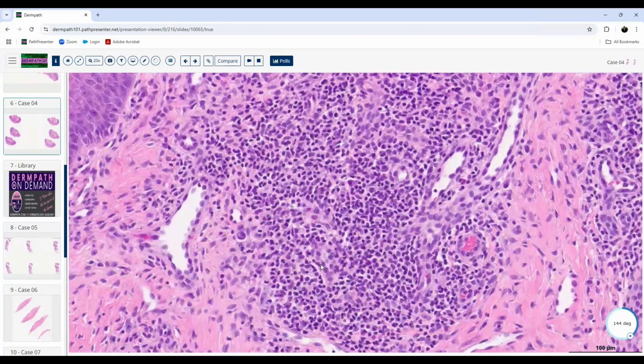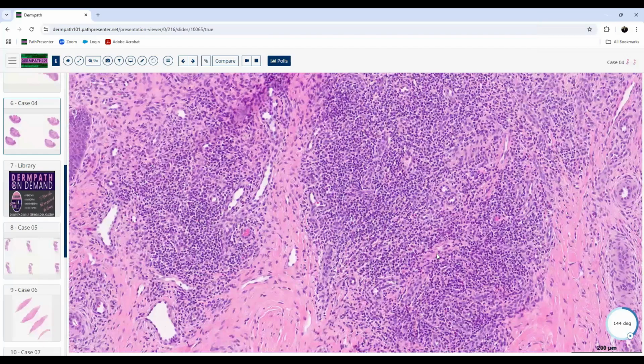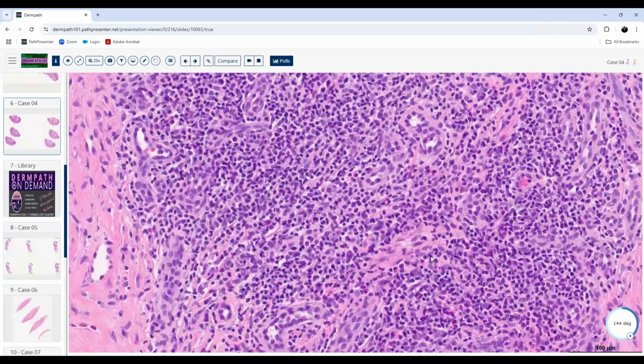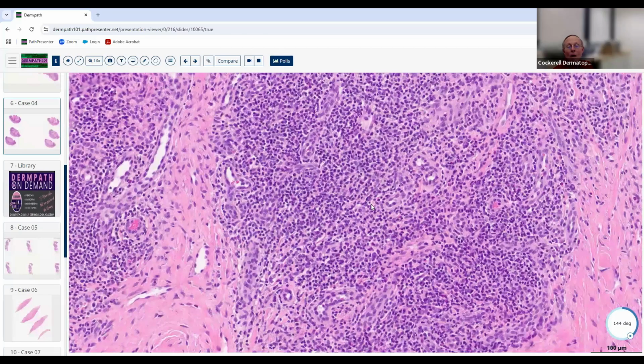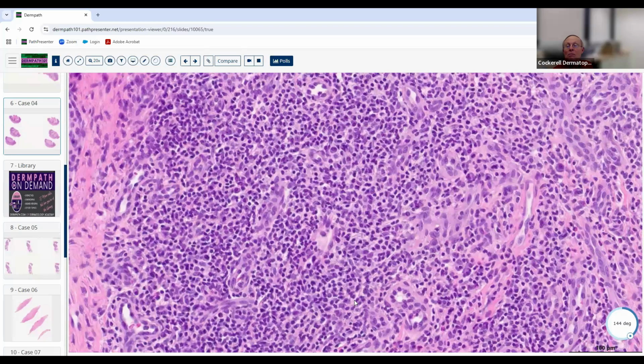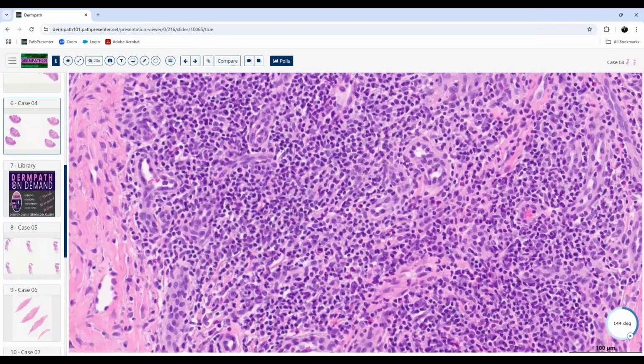Okay. Anything else? Some of the vessels seem to be conglomerated into what looked like lobular structures in areas. Okay, I'll buy that. And you said there's a lot of lymphocytes in here. Any other cell in here? I was looking to see if I could find a lot of neutrophils, but I didn't think I saw too many. Maybe a few eosinophils. I agree, I don't see any neutrophils either. Maybe a couple of plasma cells. What about these? Yeah, maybe some eosinophils right there. Okay.